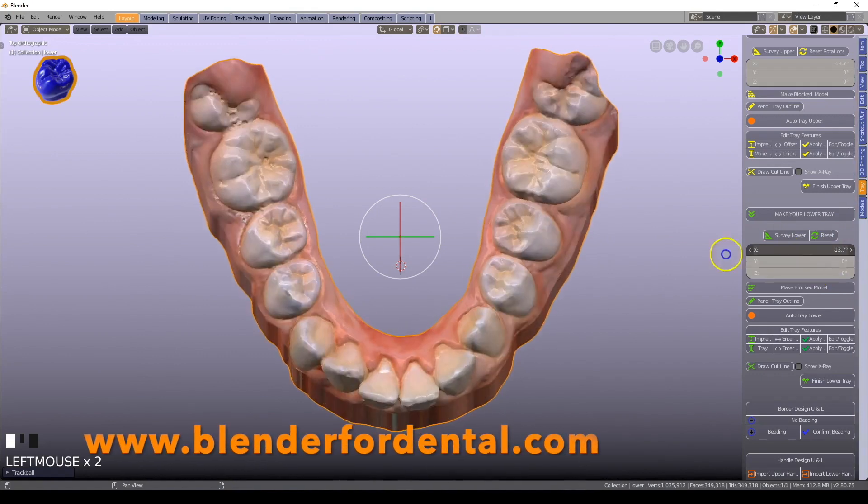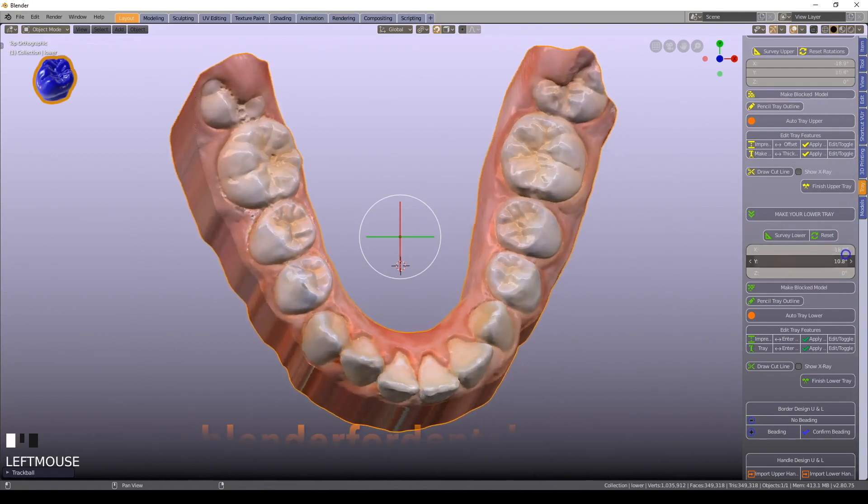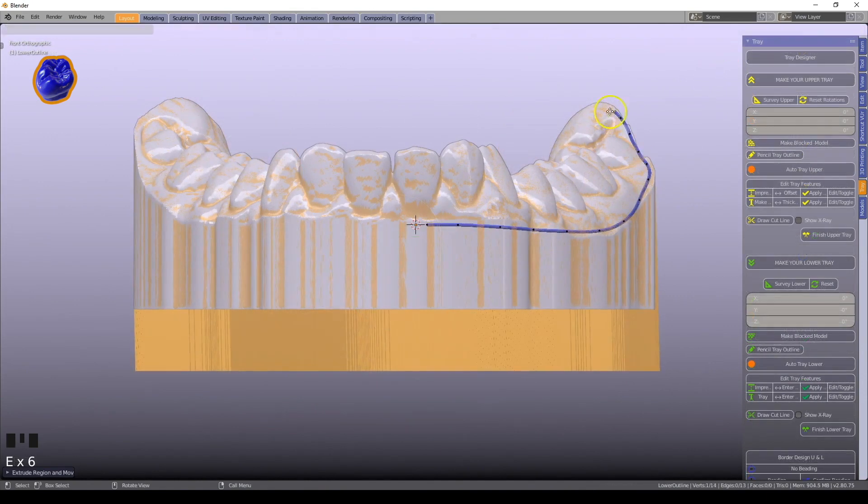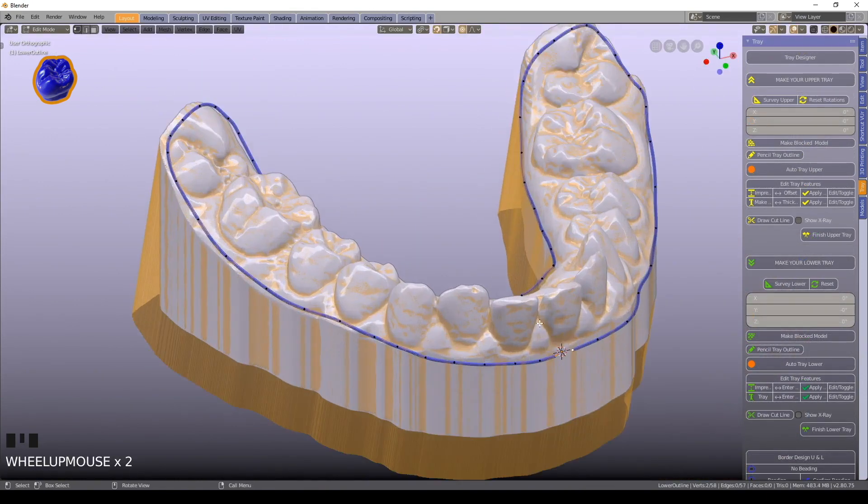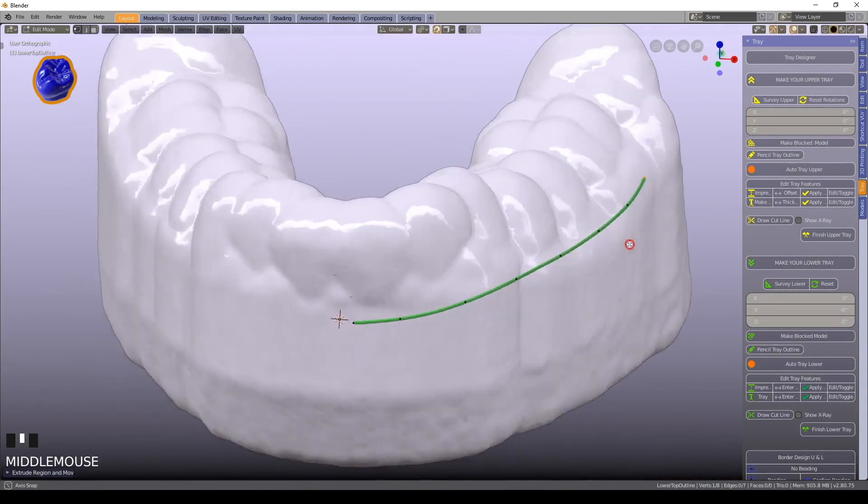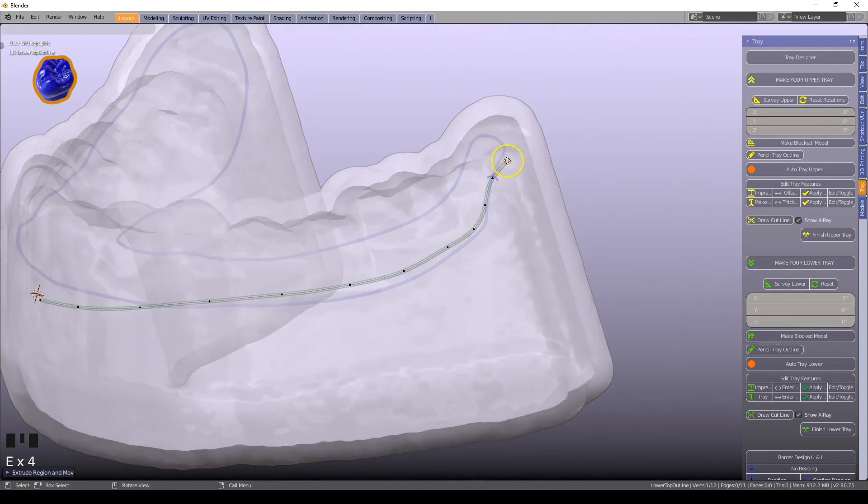The Tray Designer is the latest addition to the Blender for Dental add-ons, for the free and open-source Blender 2.8. The Tray Designer is perfect for designing your custom trays for 3D printing.